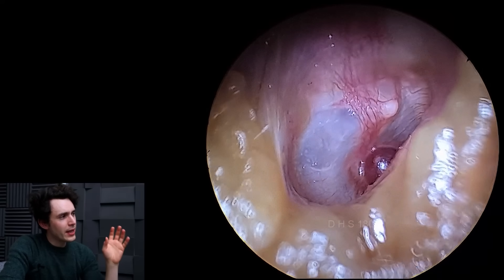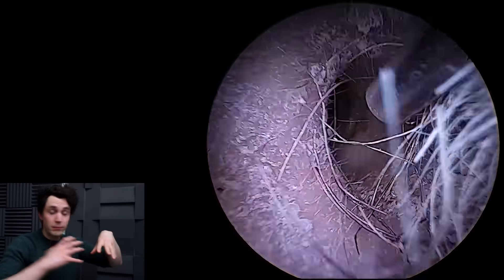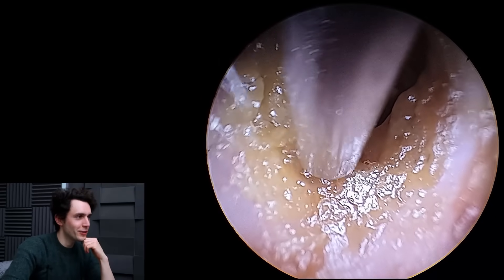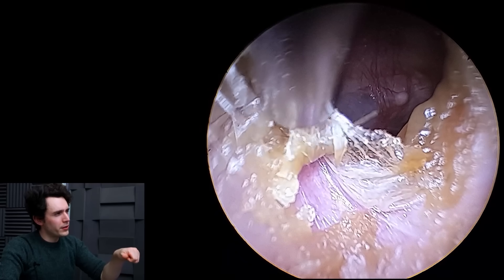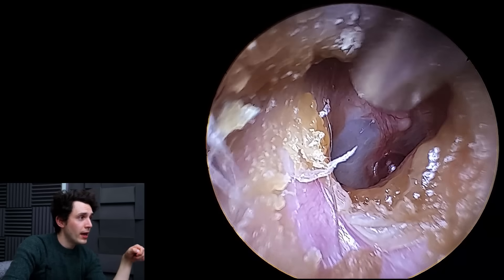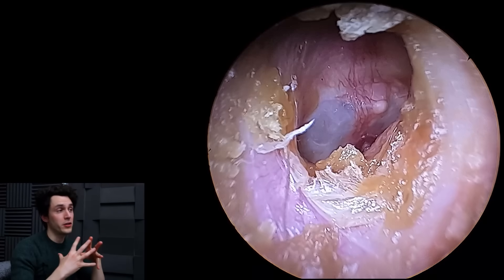What we have here is a hemorrhagic bleb on the drum, which is just a blood-filled sac or a hematoma — a bruise, whatever you want to call it. Essentially what's happened is this patient has jabbed a cotton bud down onto the drum, causing acute pain.